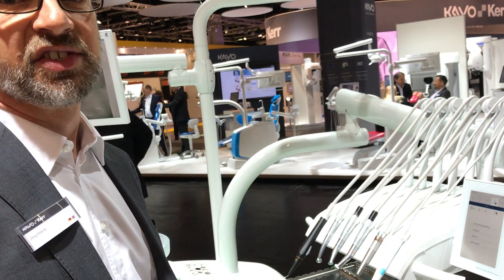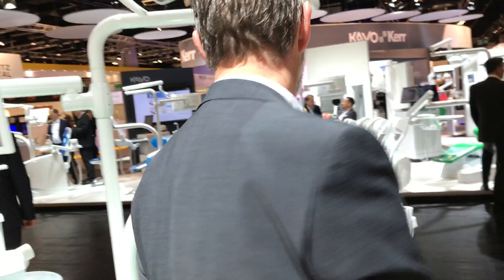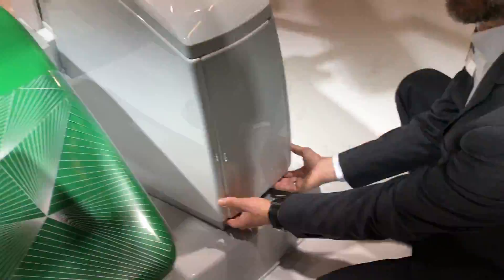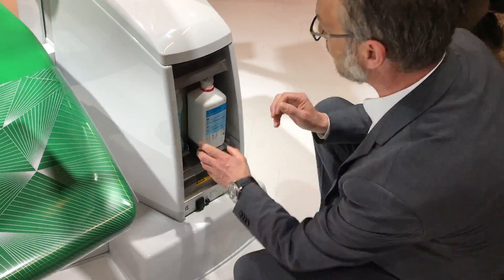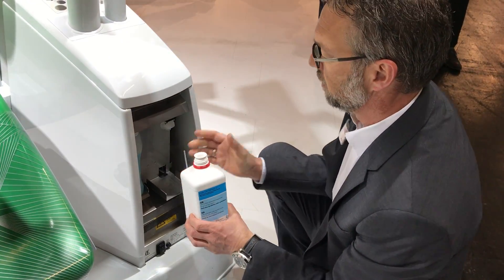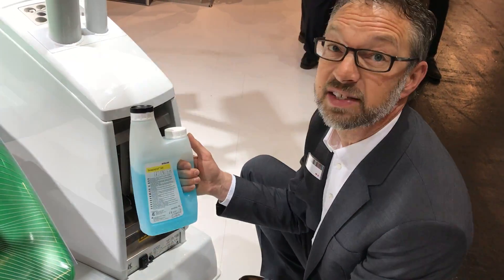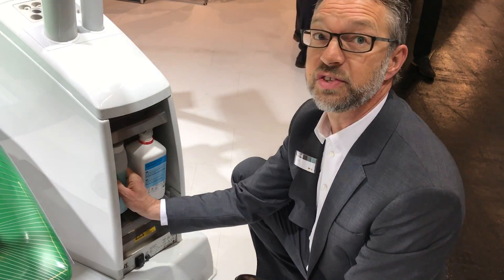If some chemicals are empty we can easily exchange the bottles. We have to open the cover in front of the treatment unit. We take out the empty bottle of Oxygenal, for example, and replace it with a new bottle. The same works with Dekaseptol Gel. This is the cleaning and disinfectant for the suction system.